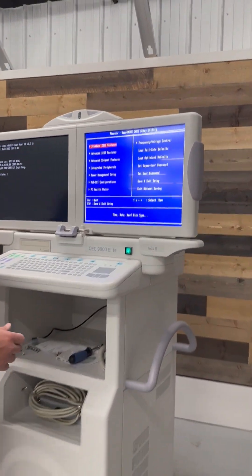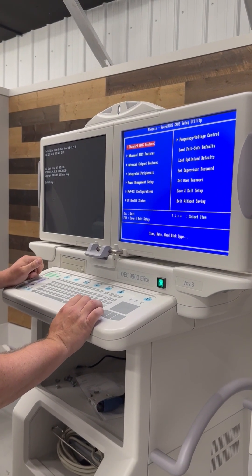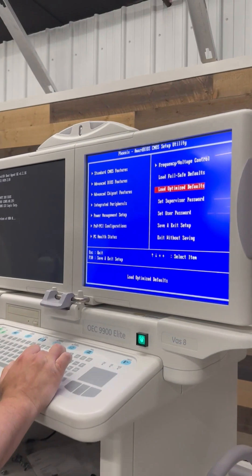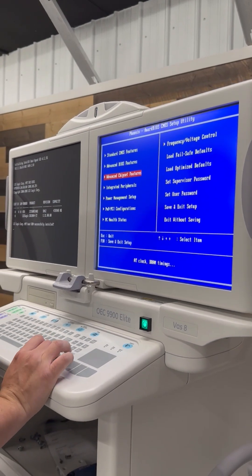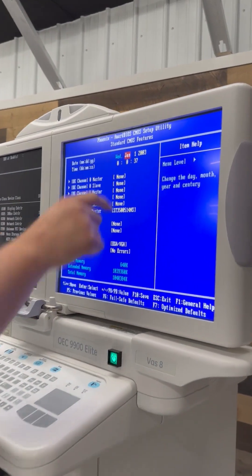That's going to take it to the Award BIOS. What we're going to do is go down and load optimized defaults. We'll hit Y for yes and hit enter.